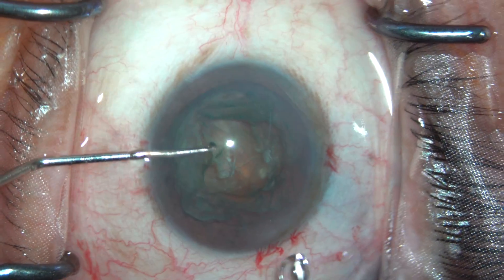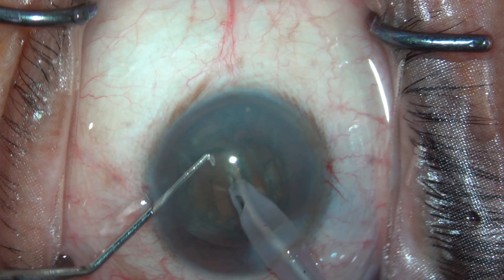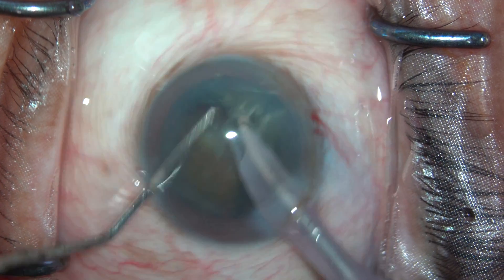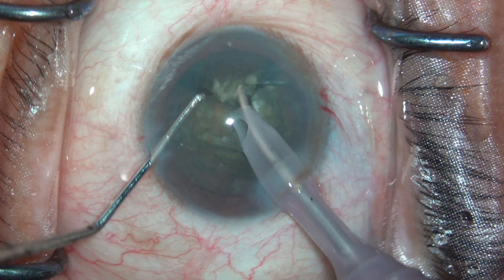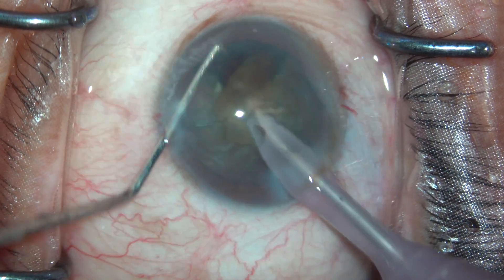Going towards phacoemulsification, I prefer to use a sharp chopper — this is a combined chopper. Going with a direct chop, a good crack is achieved by embedding the phaco probe tip nicely into the nucleus, rotating and then chopping, then rotating the nucleus into smaller pieces and emulsifying.